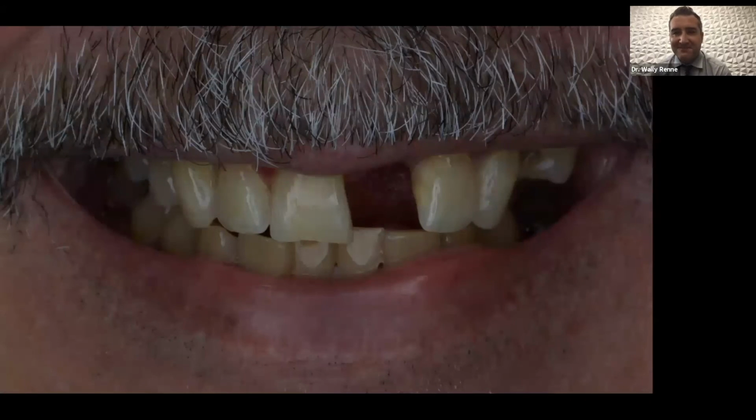So here's a perfect case in point. This is a very similar case, actually. This patient, once again, cannot get an implant at this site. And so we're going to do a resin retained fixed partial denture, an adhesive bridge or Maryland bridge, or if you're in Europe, you might call it a Yamashita adhesion bridge. And so what do you notice at first? At first I was like, yeah, we're just going to go ahead and slap a pontic in there. But then I got to thinking, the space doesn't seem right.